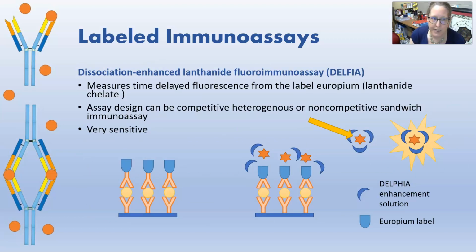Then you have DELFIA, dissociation enhanced lanthanide fluoroimmunoassay. It measures time-delayed fluorescence from the label europium, which is a lanthanide chelate. The assay design can be competitive, heterogeneous, or non-competitive sandwich immunoassay, and is very sensitive.